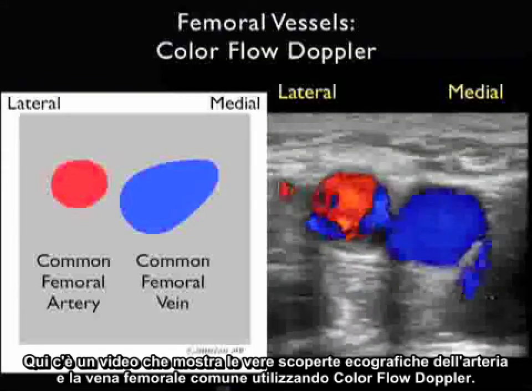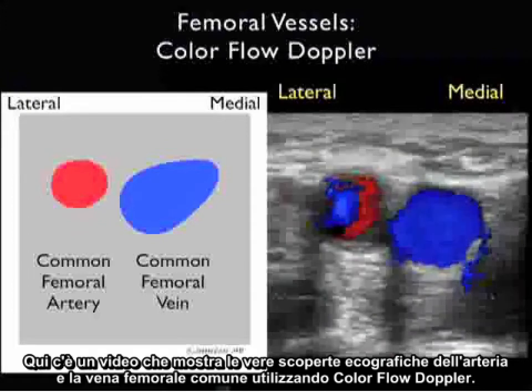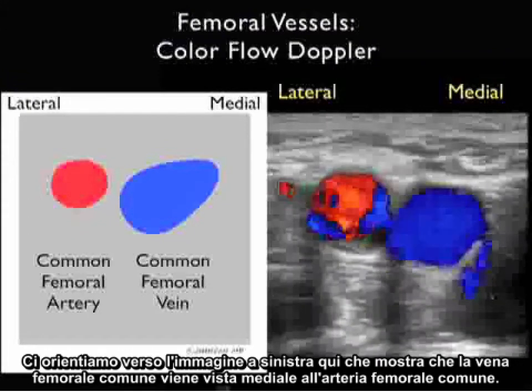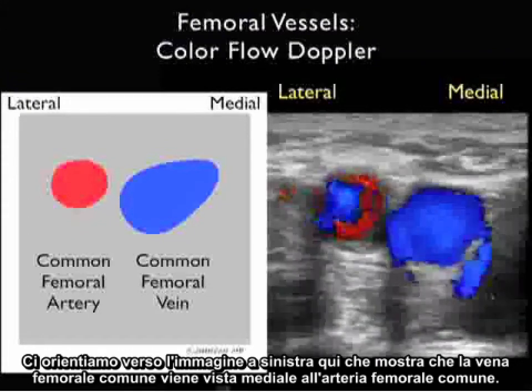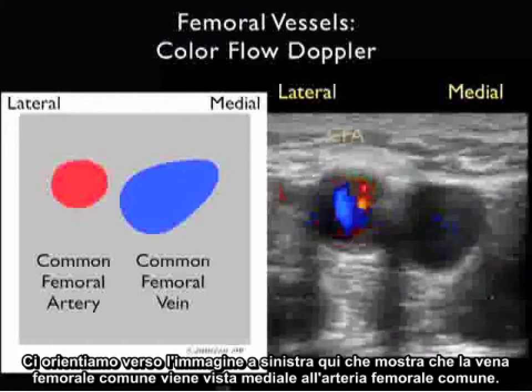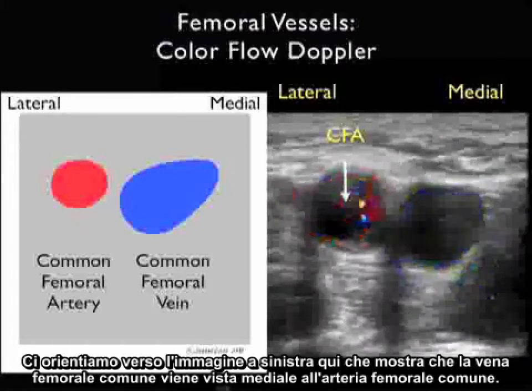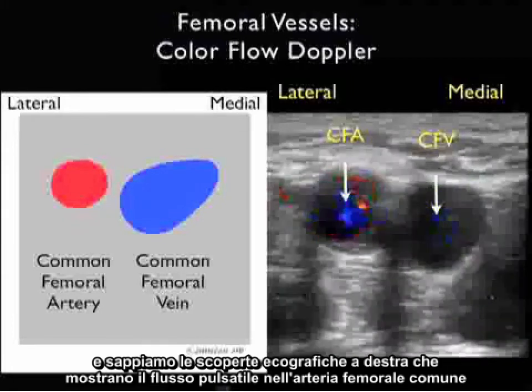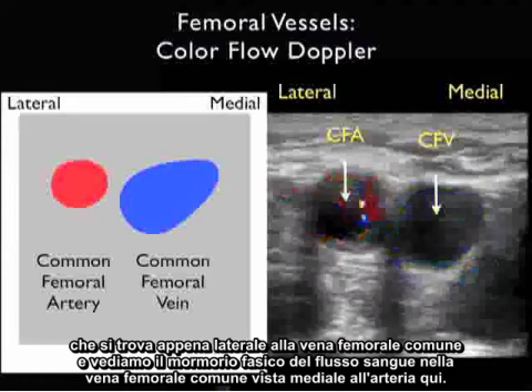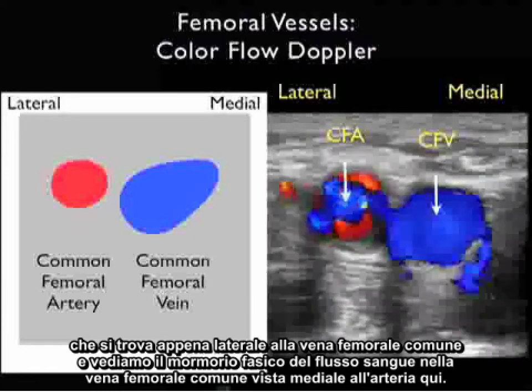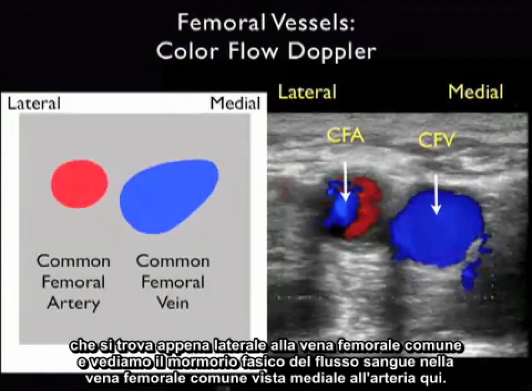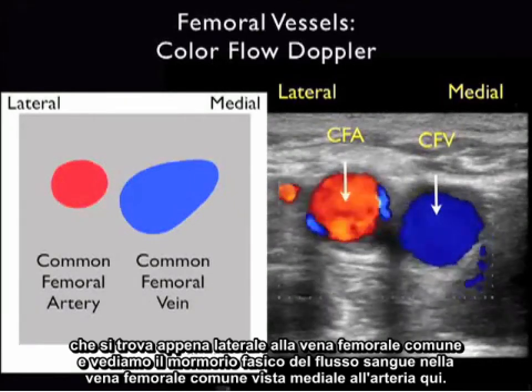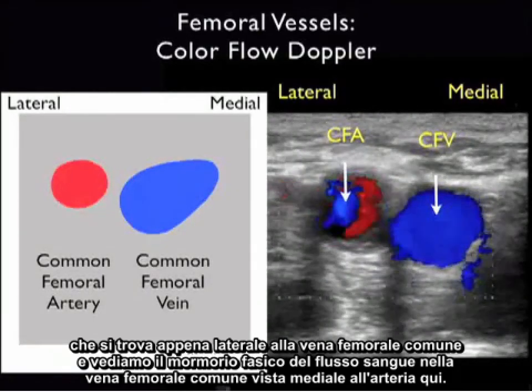Here's a video showing the actual ultrasound findings of the common femoral artery and vein using color flow Doppler. We orient ourselves to the image showing that the common femoral vein will be seen medial to the common femoral artery. We note the pulsatile flow within the common femoral artery located just lateral to the common femoral vein, and the phasic flow of blood within the common femoral vein seen medial to the artery.